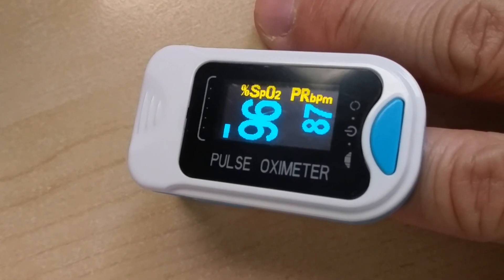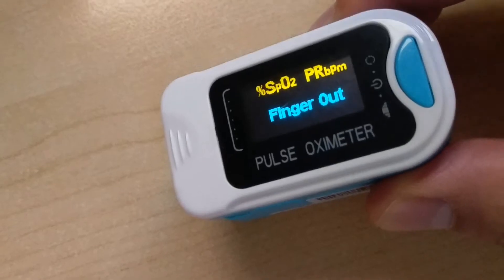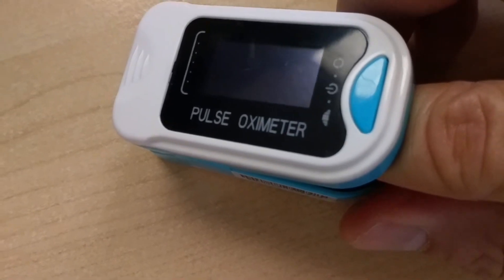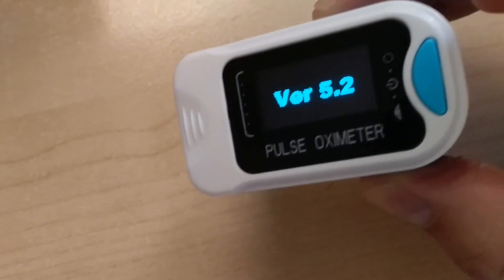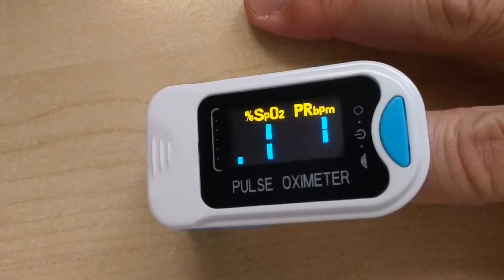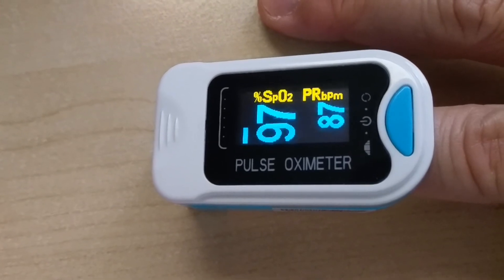Maximum pulse oxygen saturation is 100% and that is an ideal number. Unlike apps on phones, this optical sensor uses a red light wavelength around 660 nanometers and also an infrared optical sensor with wavelength around 880 nanometers, so it's more accurate than, for example, a phone and an app. And if we do it again, you can see that the numbers come back really quickly.